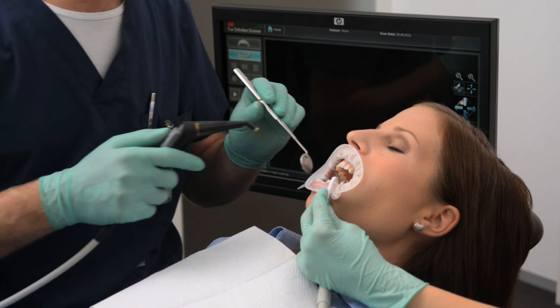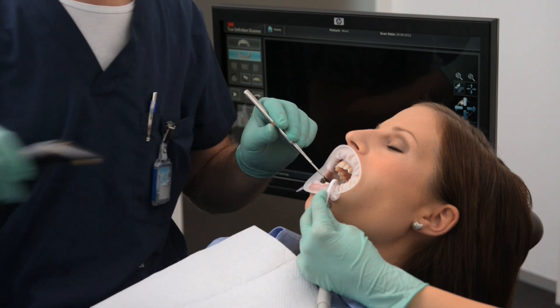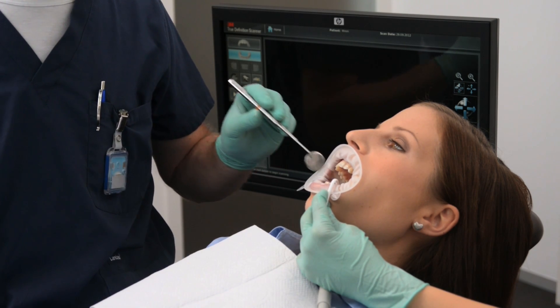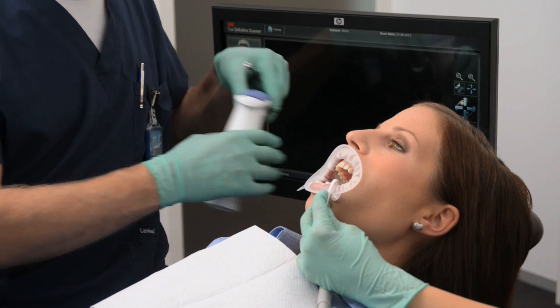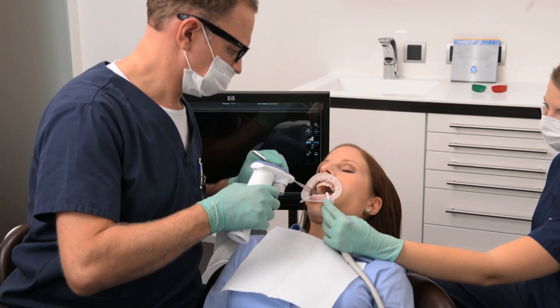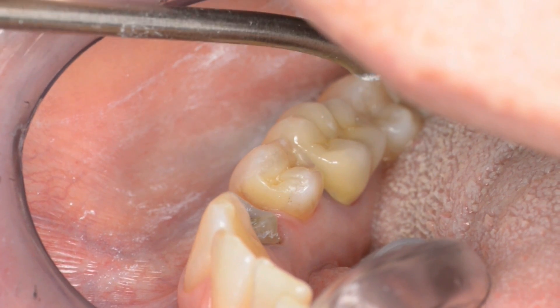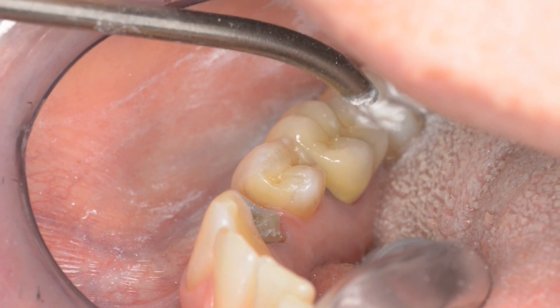Powder application. Make sure the prepared area is completely dry before applying powder. Do not pump the trigger. Hold the trigger down halfway to dispense powder in a nice even flow. To lightly powder the prep, begin spraying a tooth far from the prep and pass over the prep, avoiding any initial burst of powder.